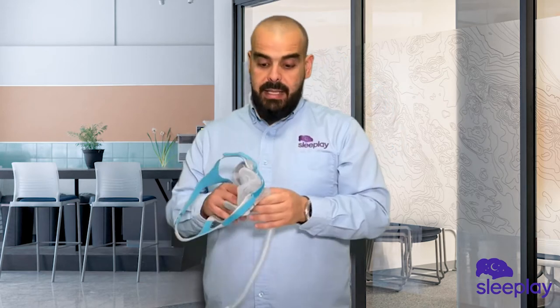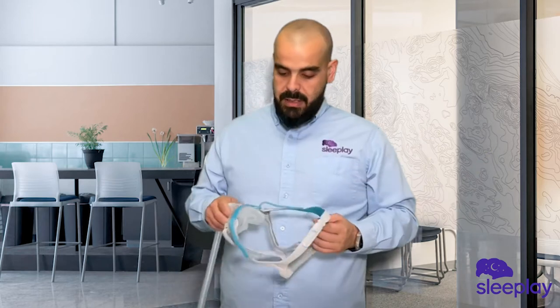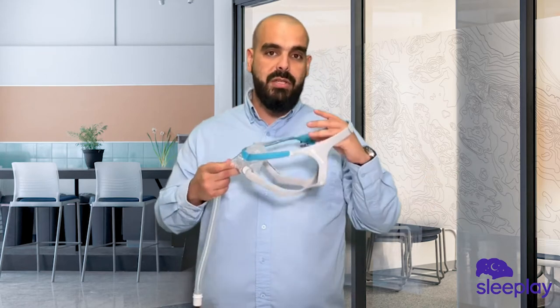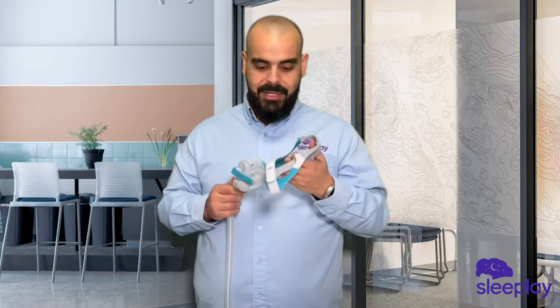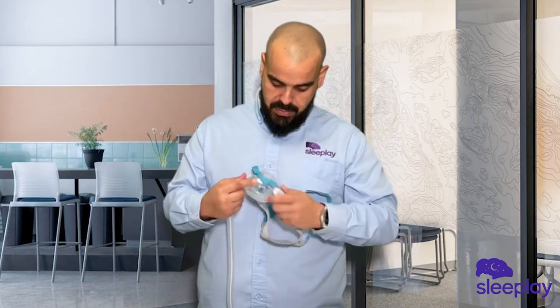It's similar to the Fisher & Paykel Vitera, which is also a great full face mask from Fisher & Paykel, but this is the newest one in their lineup. Seeing the competition, they had to come out with something to rock the competition a bit, and with this mask they're doing something — I can tell you that much.